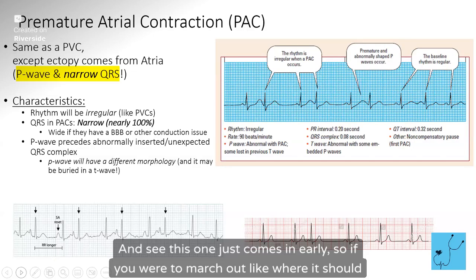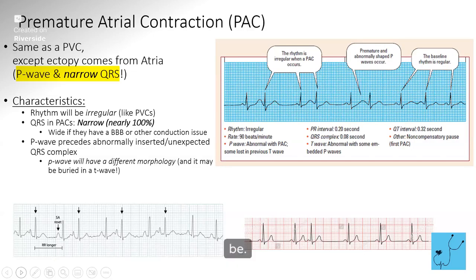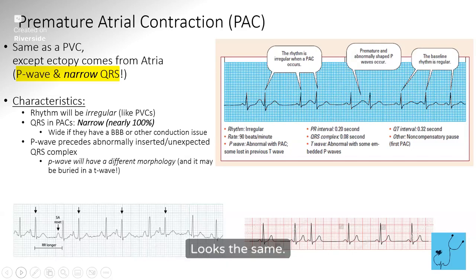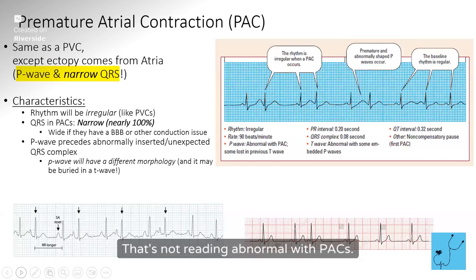So if you were to march out where it should be, they all march out, but these just come in early and it's the same shape, looks the same. That's like a hallmark thing about it. So here's another example of a PAC.